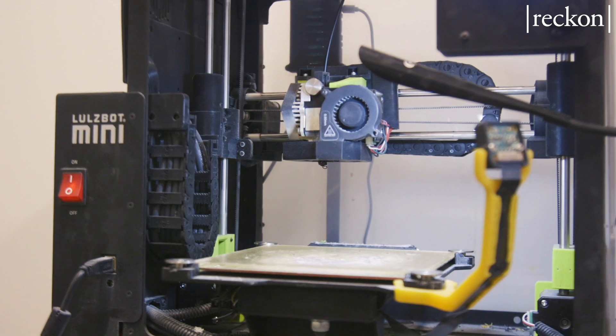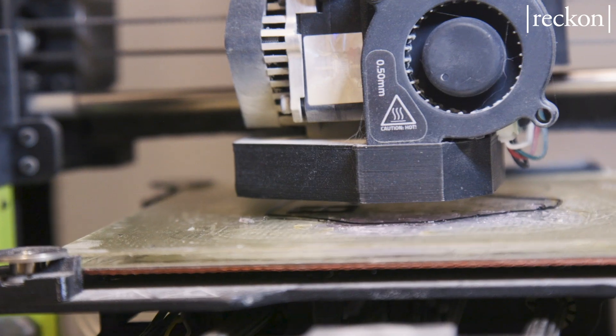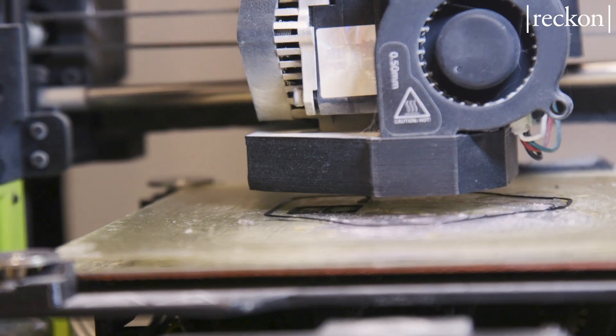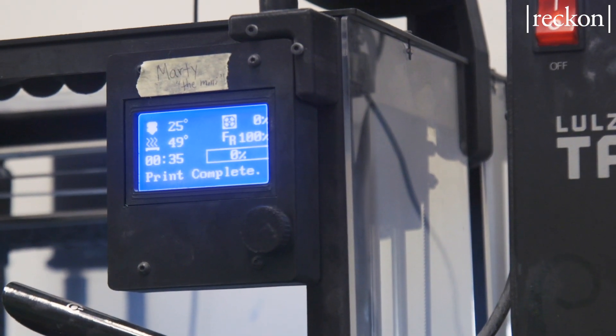One of the benefits of our mask and what we did with the 3D printing was that you can get them wet and just wipe it off — it's easy to disinfect. And if something gets on the filter, you can pop off the filter and go back to whatever it is that you're doing.